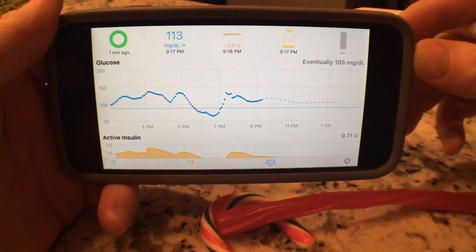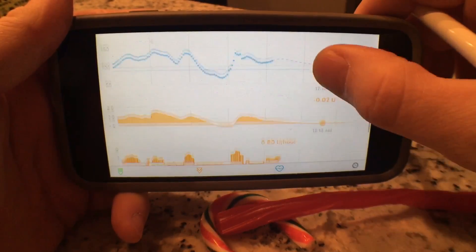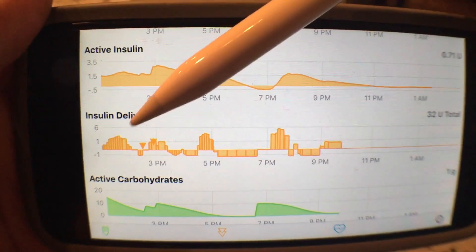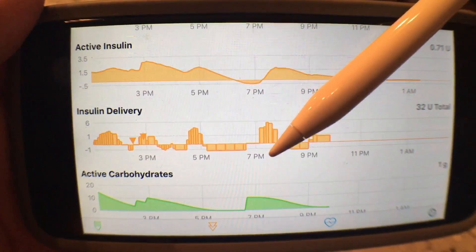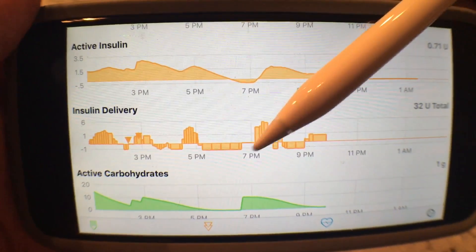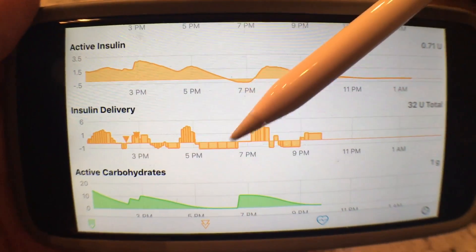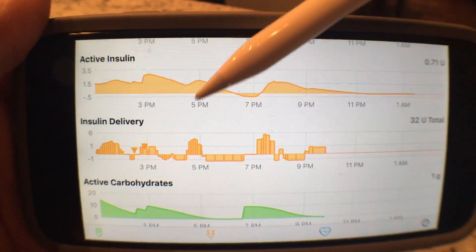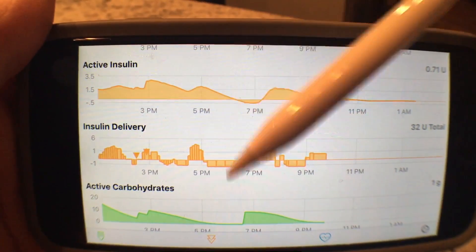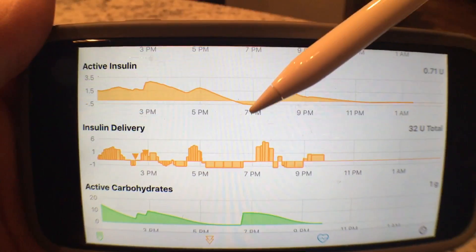And then this is your settings for Loop itself. If you rotate it sideways, you can see a much more detailed view. These two triangles — I gave myself a bolus of insulin, and the rest of this is actually a temporary basal. Anything here above the line means it gave a temporary basal; this means it suspended it. This area here is where I was actually outside doing yard work and leaves, and it noticed that, so it suspended the insulin so that I wouldn't go too low.